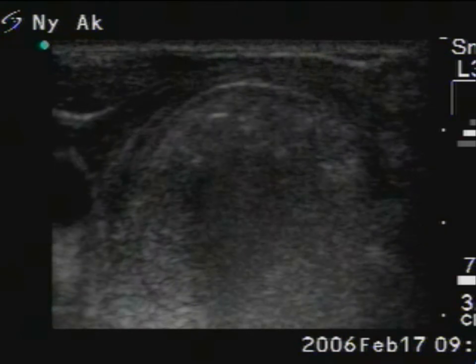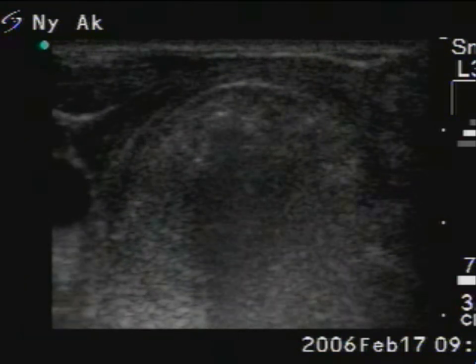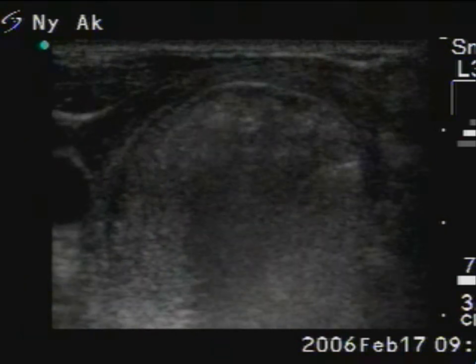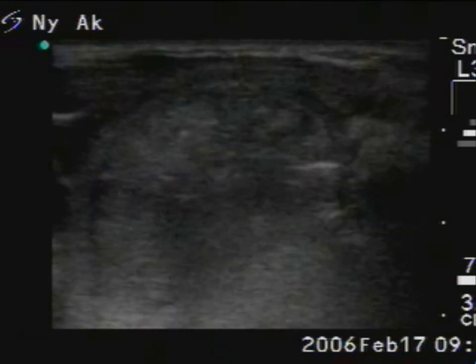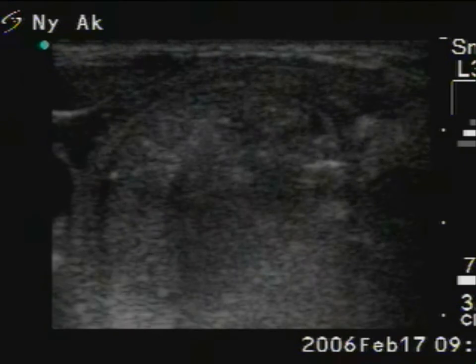Now, we change the location of the needle in order to treat the ventral part of the nodule.